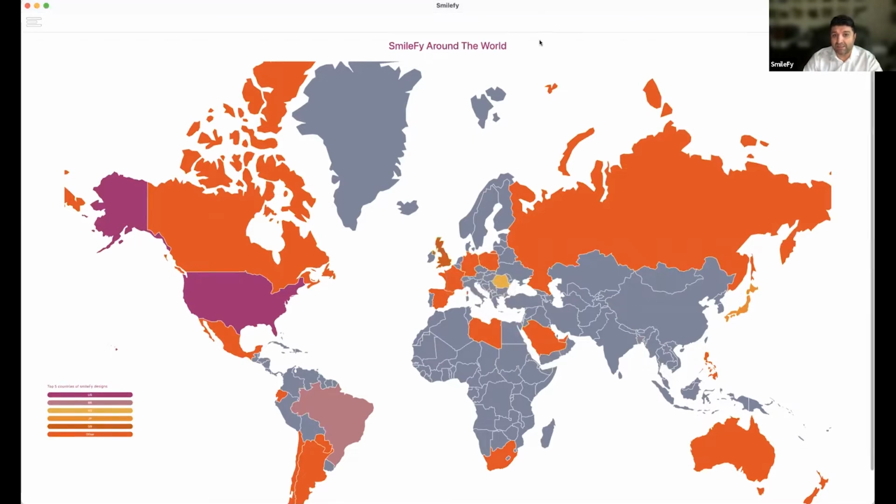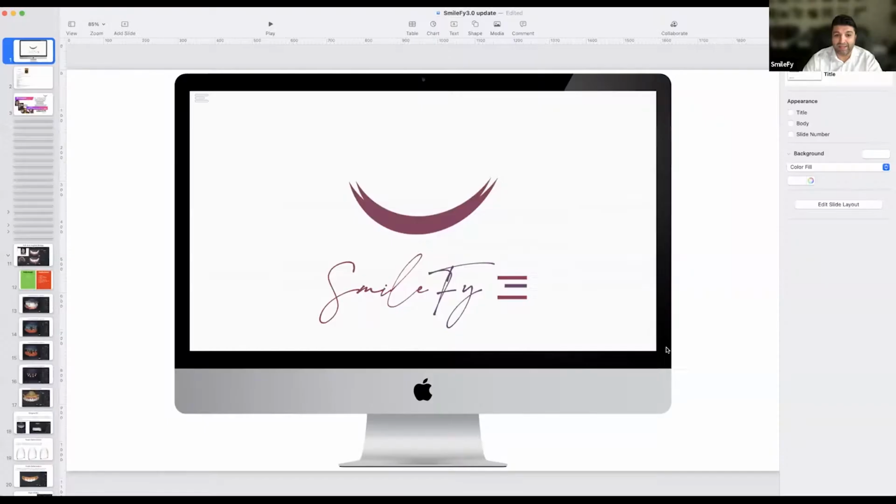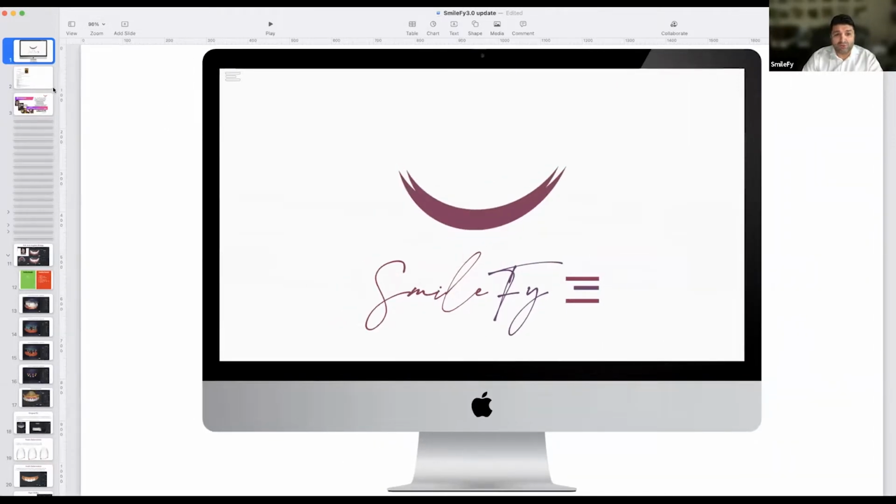That's the best thing we can do, because at the end of the day, no war started with a smile, right? When people give a smile, they get a smile back. That's the most beautiful thing that we can do. Today we're going to talk about the full arch implant bridge and the designs and the workflows.